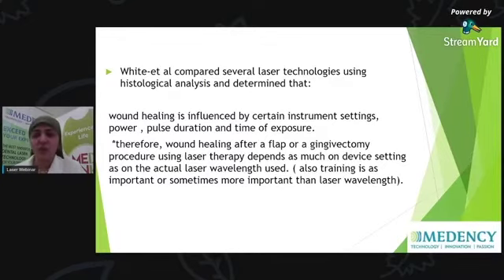There is not much blood and hemoglobin pigment in the tissue I'm facing. So if I'm not trained well, I will not know how to set the power of the laser for my procedure. If I set the parameters higher than they should be, I will cause carbonization.